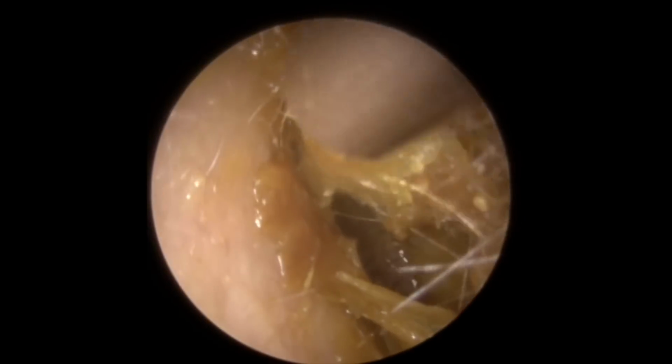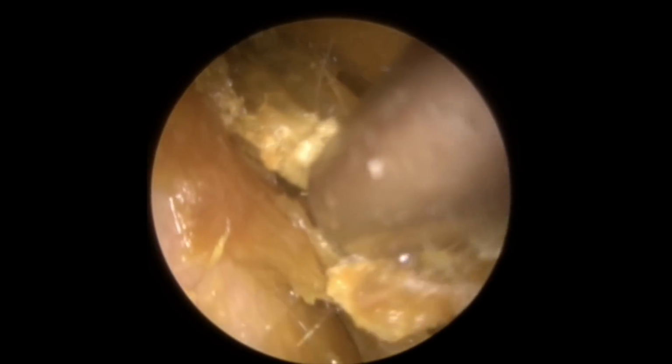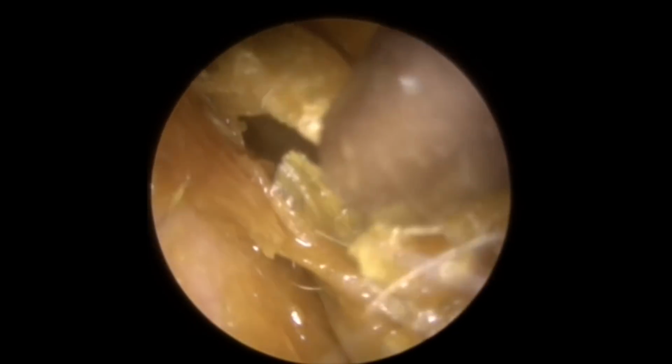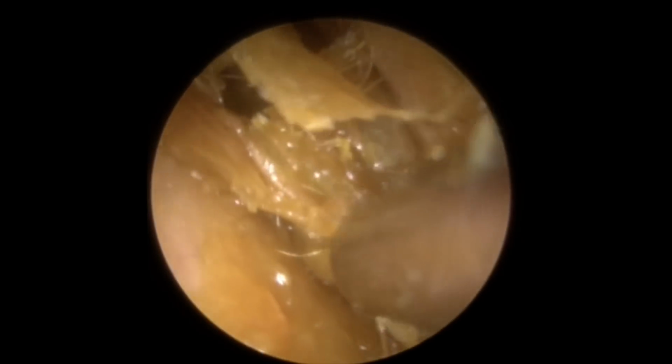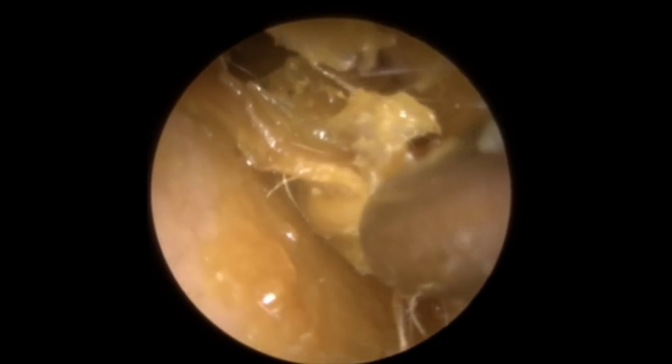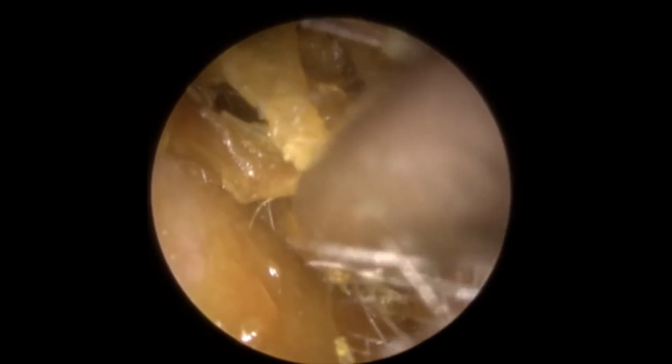So we're just taking this away now using the standard size Zollner again. We're going to need to clear this out because if you imagine trying to aim for the center of this pocket, this sleeve, all you're going to do is pucker the skin up into the suction, which is what's happening here. So we have to get rid of this.